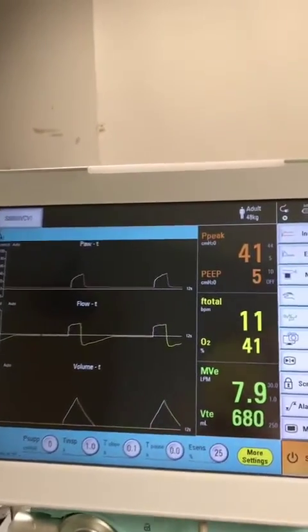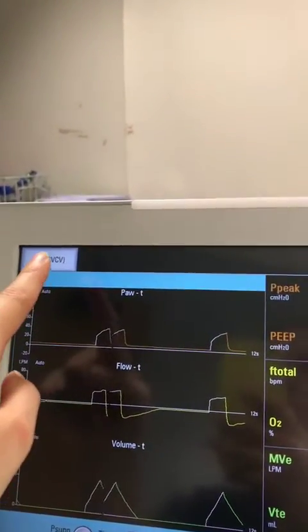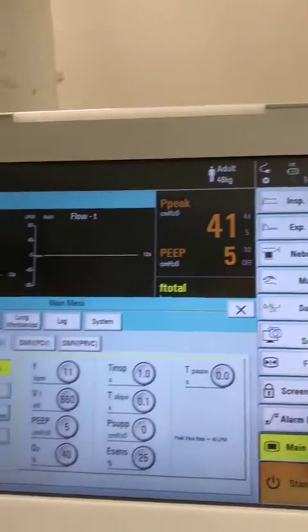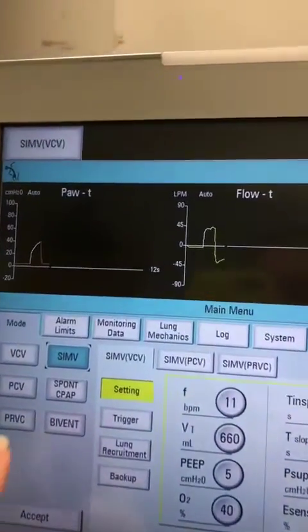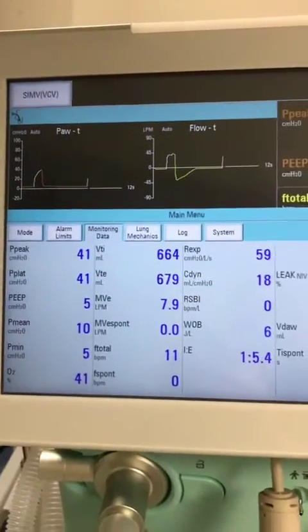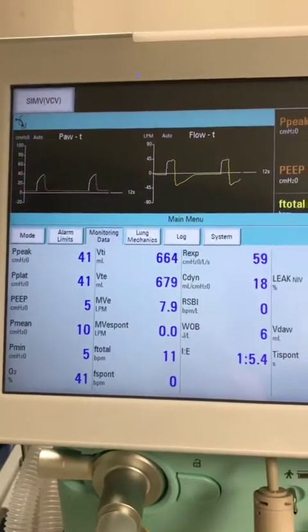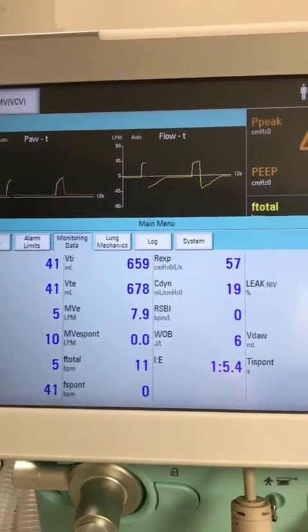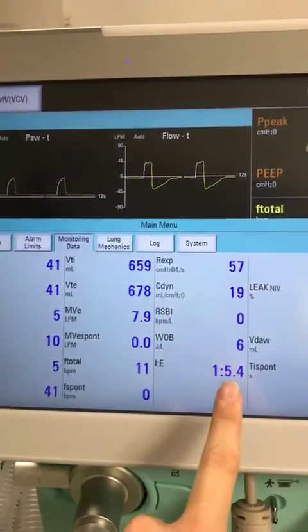To find more observations, you can either touch the mode button or go to the main menu button down here — they both bring up the same screen. Then if you go into monitoring data, you'll get a lot more information including your plateau pressures, P-mean pressures, and an IE ratio.